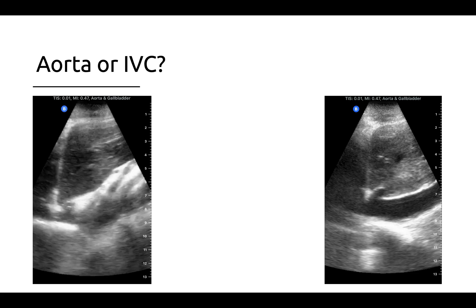Several visual cues can be used to differentiate these two vessels aside from their relative locations. Notice that the aorta has a fairly sharp posterior-to-anterior angle as it runs from the thorax down through the upper abdomen, whereas the IVC typically takes a flatter trajectory, although keep in mind that these angles will appear differently depending on the orientation of your probe in relation to the patient.